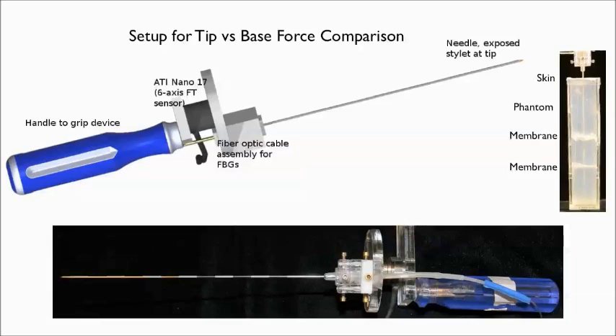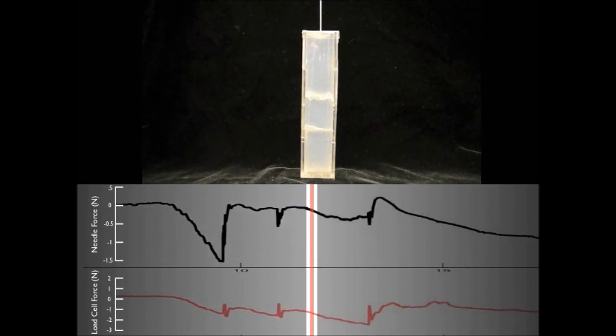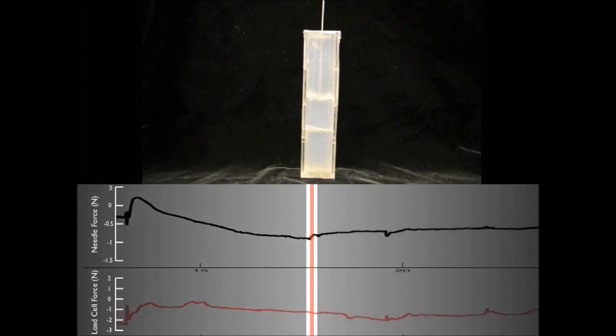A multi-layer phantom was built to simulate tissue with skin and inner membranes. As the needle is inserted, the phases of tissue deformation can be seen and membrane puncture can be detected visually as well as audibly.